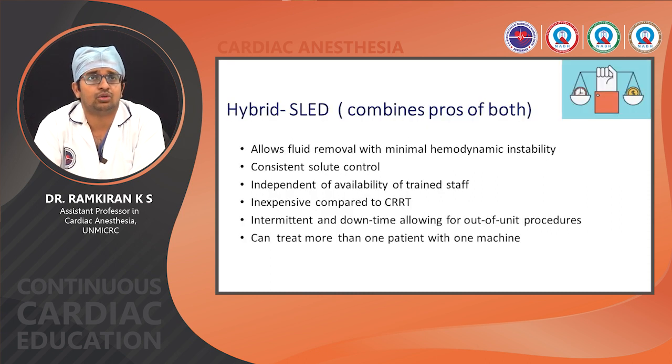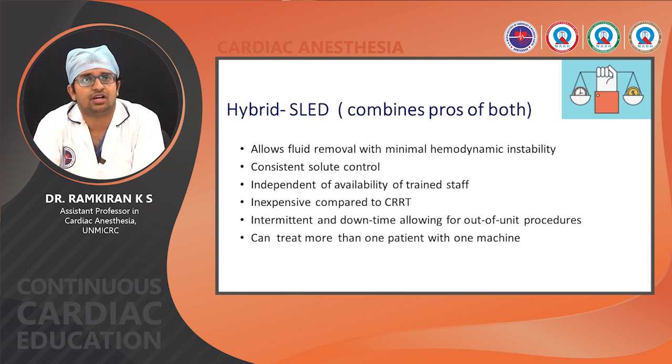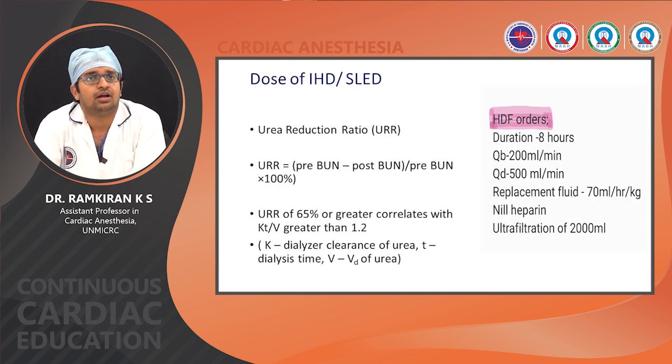Now coming to SLED, which is a hybrid, it combines the pros of both. So there is a balance here. It allows fluid removal with better hemodynamic stability. It is inexpensive compared to CRRT, and it is intermittent with downtime, allowing for out of unit procedures also. You can treat more than one patient with one machine. So it is also possible in the ICU.